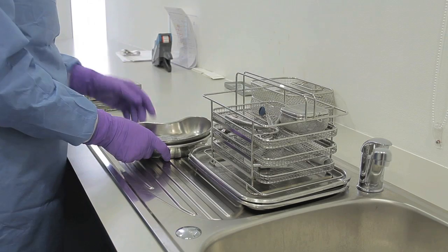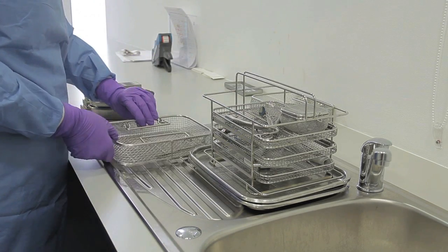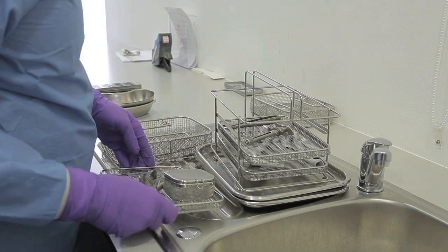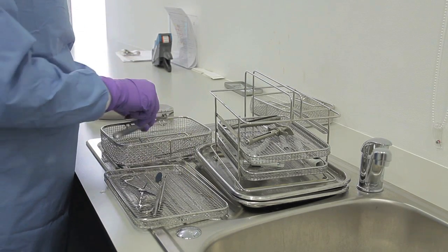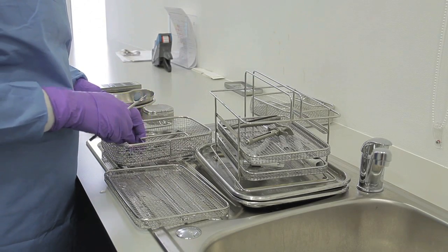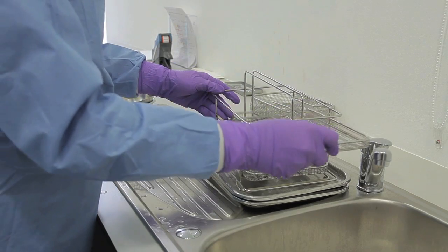The RIMD that are removed from the ultrasonic bath are still contaminated. When the cycle is finished, the dental healthcare worker removes the instrument trays from the ultrasonic bath, then places them on a metal tray to reduce spread of contamination caused by dripping water. The trays containing the RIMD are transferred to the washer disinfector holding area.